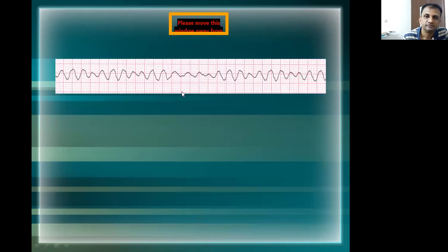This one, normal or abnormal ECG, a rhythm strip. Ventricular fibrillation. Yes, absolutely. Whether you pick up anything else or not, you should be picking up this one. This is very important because you can't wait or delay. The moment you see this trace, you should be running for the defibrillator to give a shock, making sure it's safe to do it. Everybody should be away from the bed, and the oxygen should be off before you give a defib, or else it can cause complications.